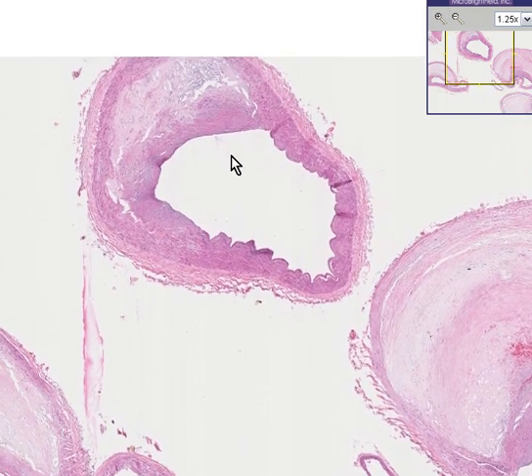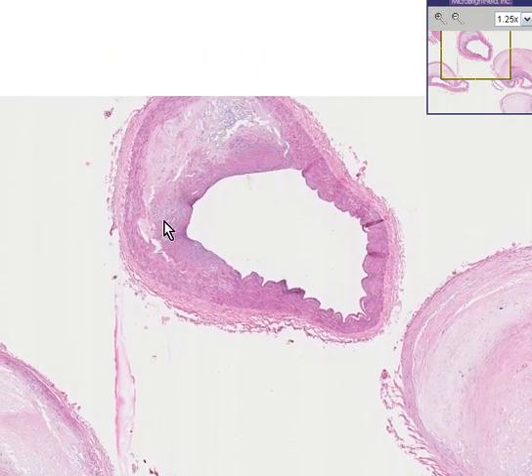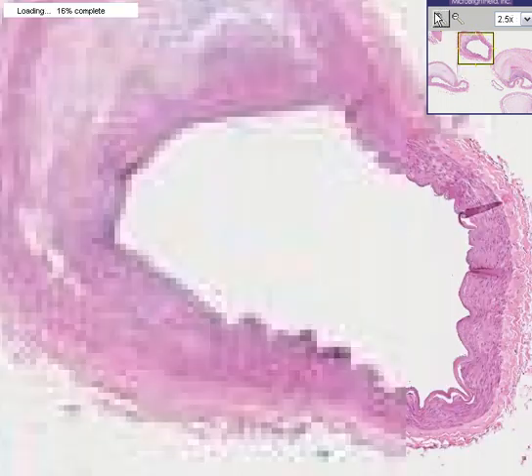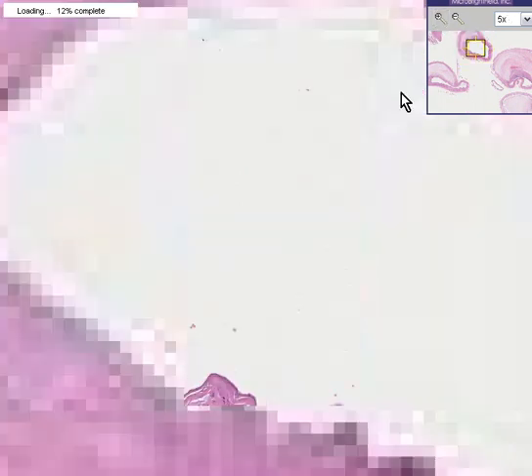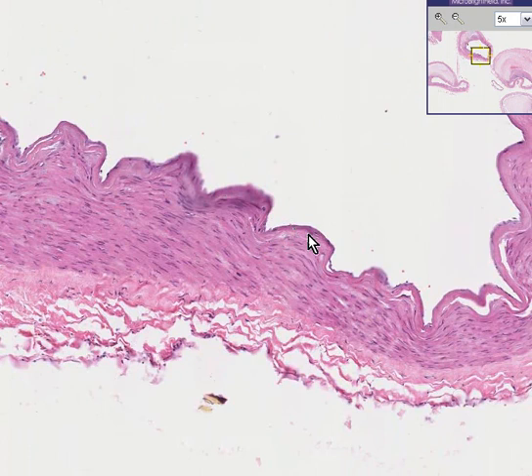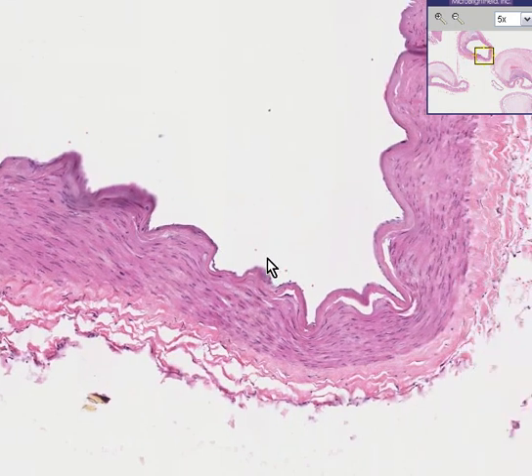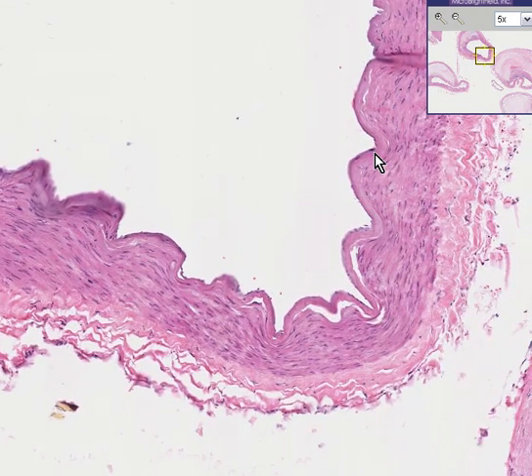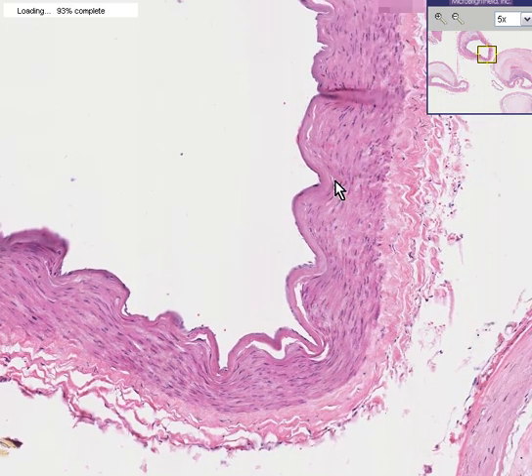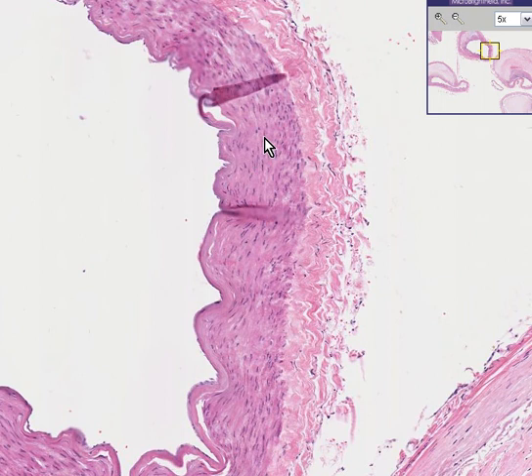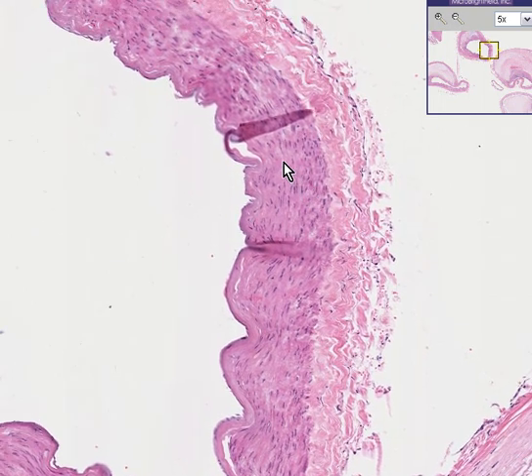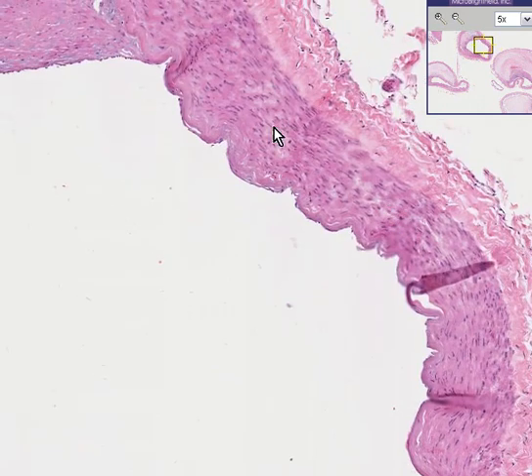These have all the classical features of atherosclerotic plaques. Please note in this area, which is relatively uninvolved, we have a nice endothelial surface. We can probably find the internal elastic lamina up here. We can see perhaps 10 or 20 layers of smooth muscle cells, then a more fibrous adventitia. This is smooth muscle; this is fibrous tissue — look at the subtle difference. This small little wrinkle is just an artifact from processing.